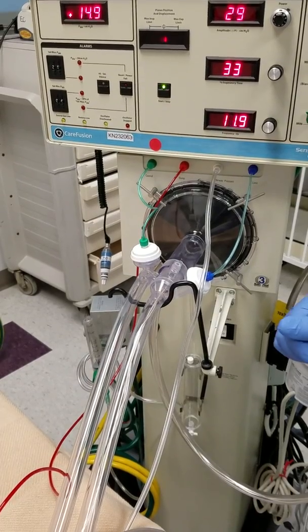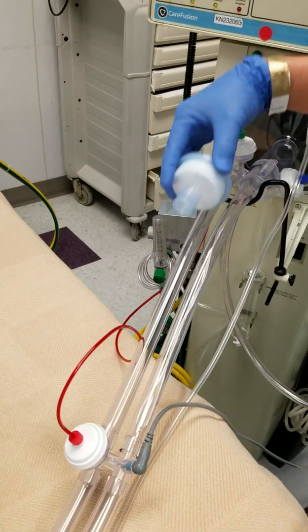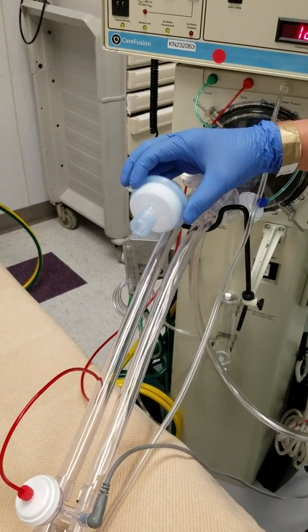Our challenge is how to add this filter that we currently have somewhere around here, but it requires some additional connection. So let's swing over here.